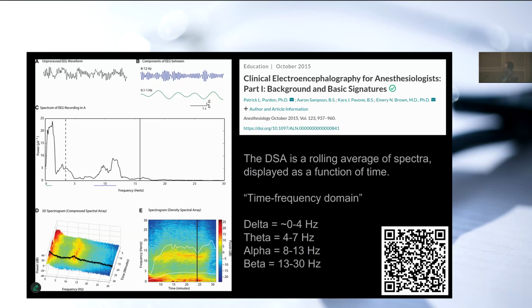If you put color on this to denote the amplitude, so that the low amplitude is blue-green and the high amplitude is red, then you can populate a single vertical line in this longer graph where the peaks at low frequencies and high frequencies correspond to these colors here. So essentially here we have time in this axis where we're looking at samples over many, maybe hours or days. And here we have frequency on the y-axis and we have color denoting the amplitude. Does that make sense? Okay.